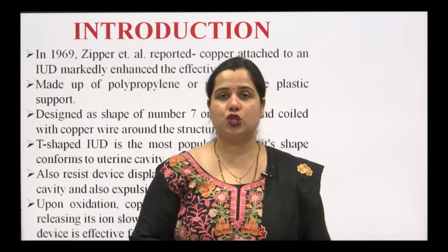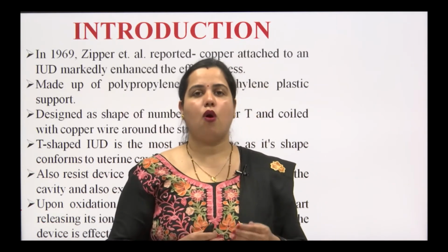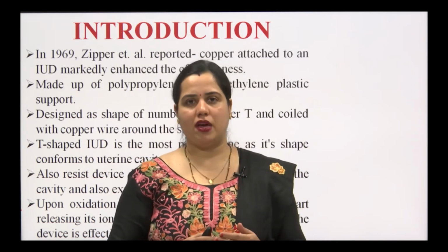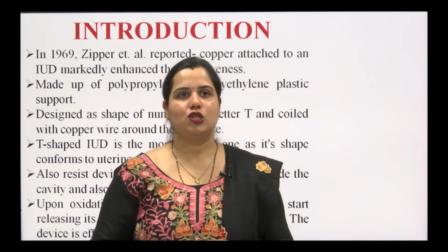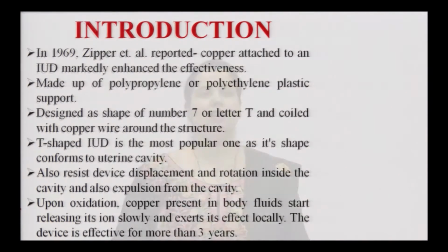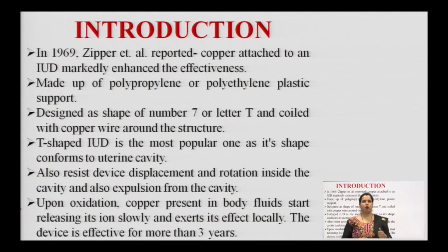Here is the introduction, or we can say the background, of how the concept of copper-bearing IUDs was initiated. So, let us have a look. In 1969, Zipper et al. reported that copper attached to an IUD markedly enhanced its effectiveness.